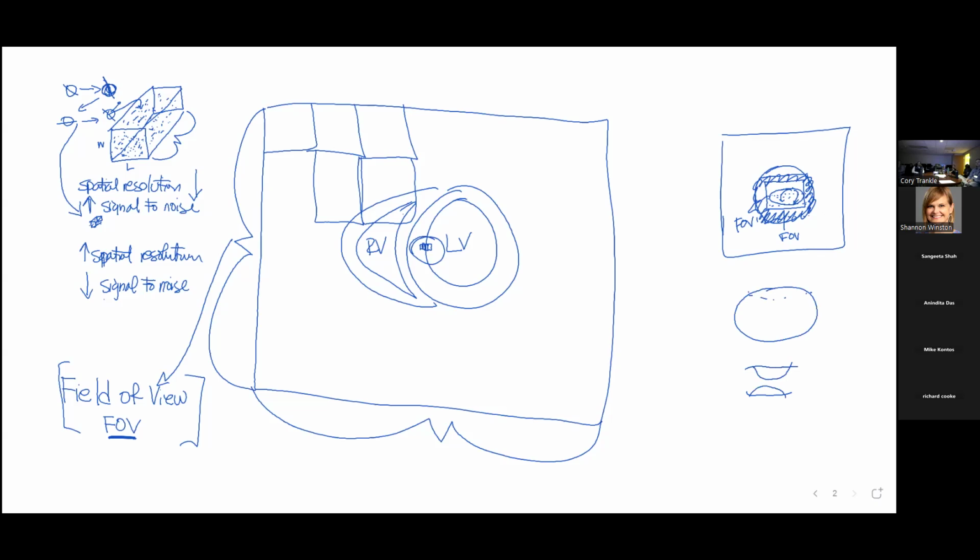All right. So the first thing is the field of view. So we're going to get that right. Now, what's the second thing? How many lines do we want to stick in here? It's just like your television set or any screen that you're working with. How many lines do we want to put in the field of view?